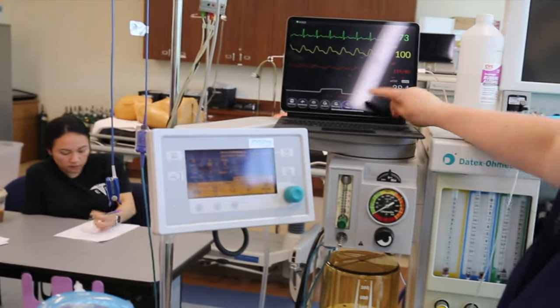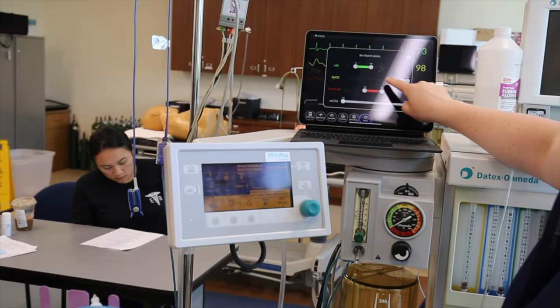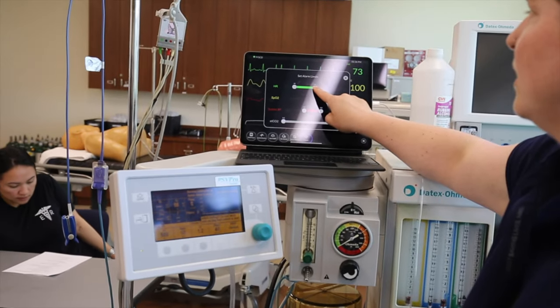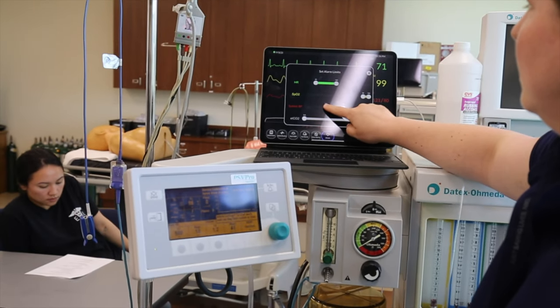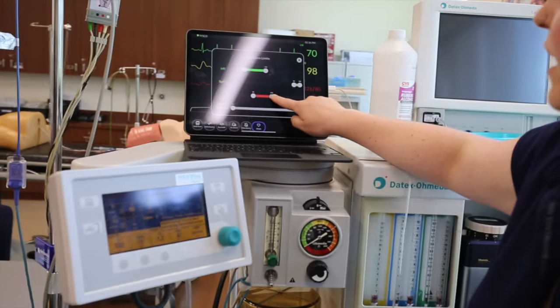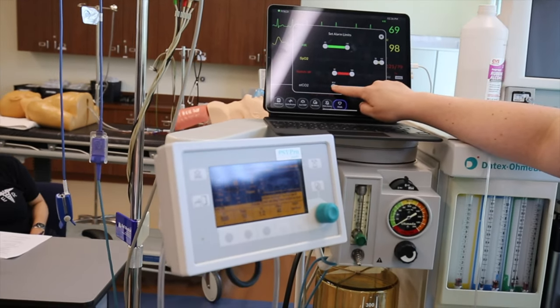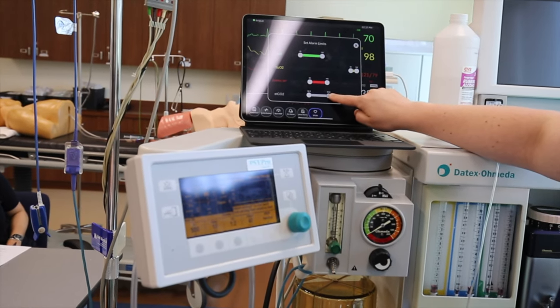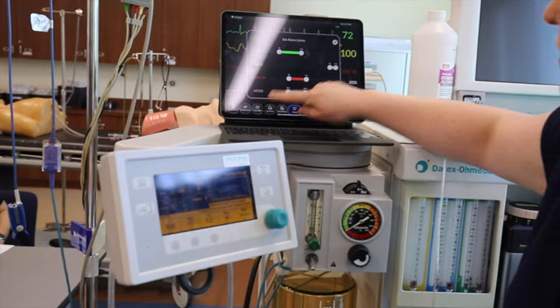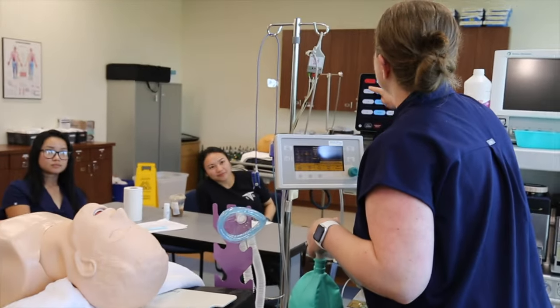Okay, so you want to make sure that you have appropriate alarm settings, so you're going to set alarms, and then adjust accordingly. So we'll change that there. Probably going to change that to 120. I'm going to set my low blood pressure to 90 and high to 165. All right, so those are my alarm settings. And I have all of the other monitors that are ASA requirements. So standard ASA, I'm just going to turn this off just so it's not interrupting me.